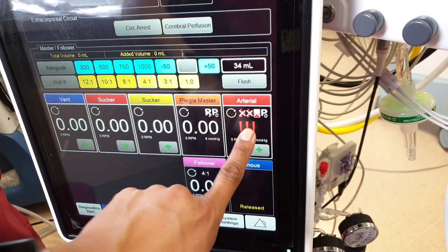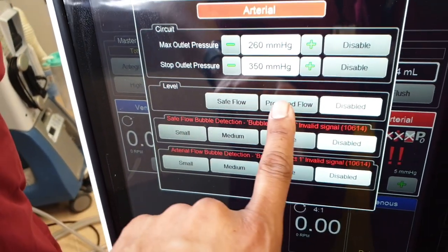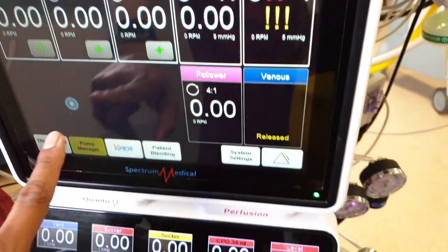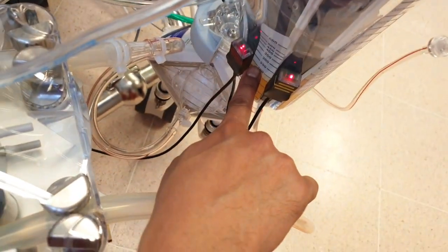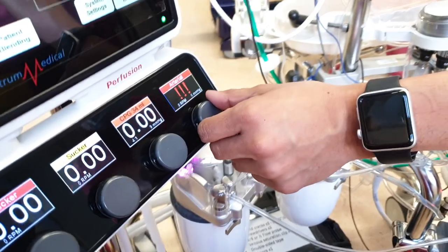So if you want to, you start that, touch that. And then on the level, I keep it protected. And then it will have a beep. And now I'm ready to drop my fluid. Did that stop blinking? Because you hit the 200 level. It means that you are engaged. It's ready. And arterial.